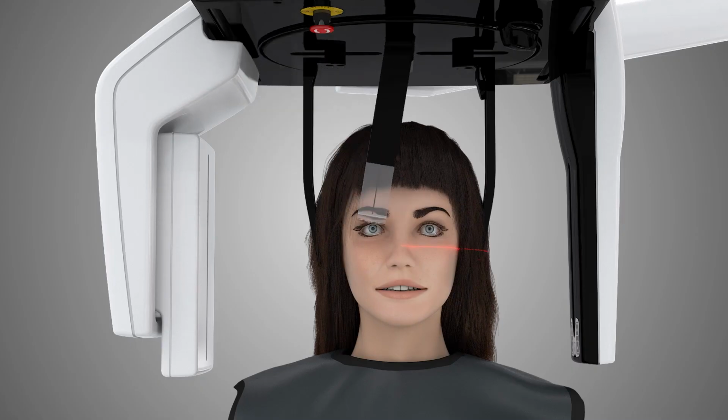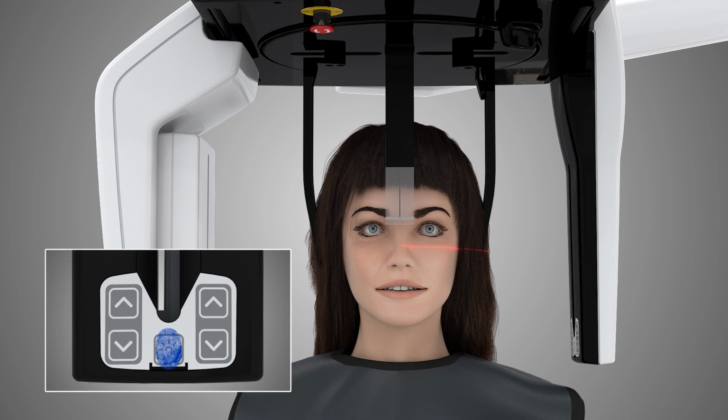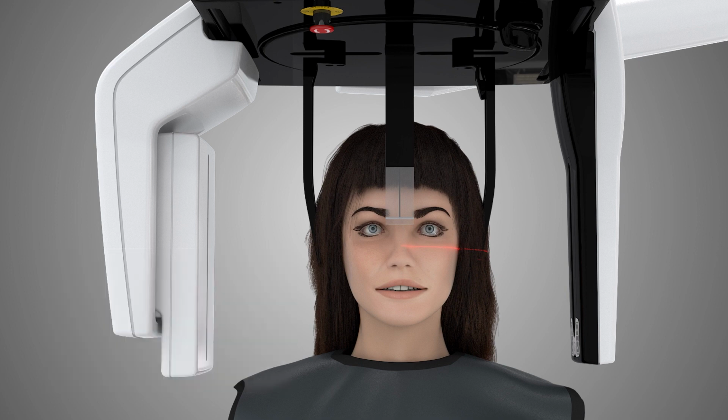Pivot the nasion support down and slide it towards the patient's nasion. Ask the patient to swallow, press their tongue behind their front teeth in a relaxed position, and remain still for the duration of the exposure. Inform the patient that the machine will emit an audible signal that will stop when the exposure is complete. Press the laser lights button to double-check the patient's position and make any necessary adjustments.